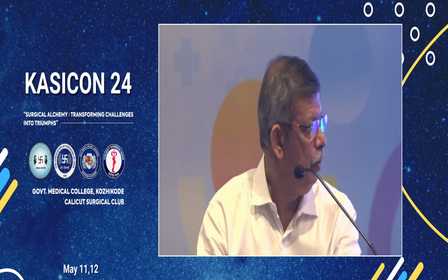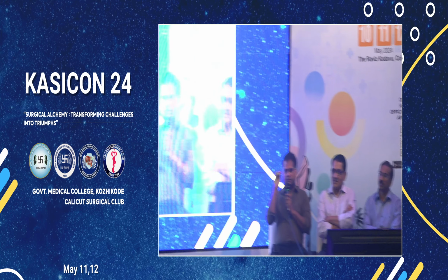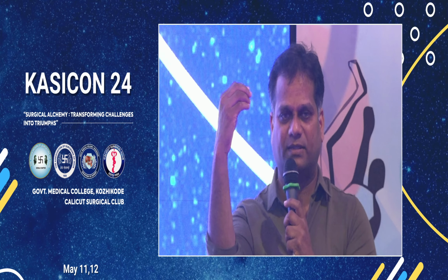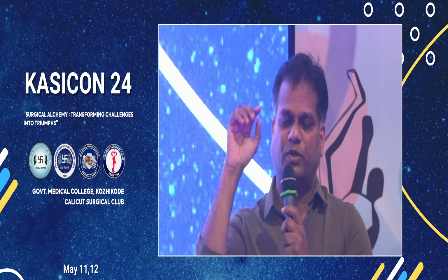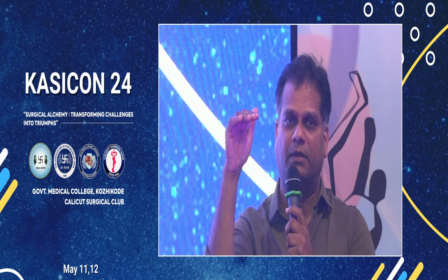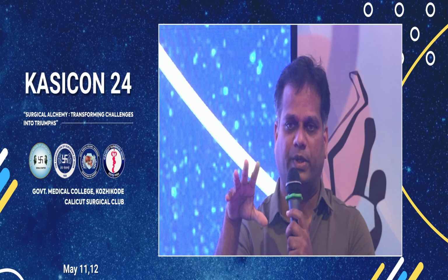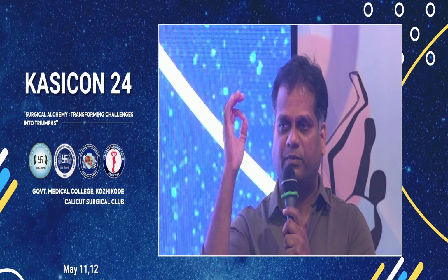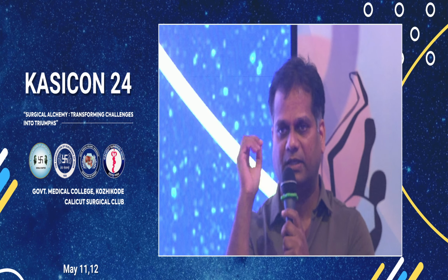Thank you, sir. A few quick points. One is for the juniors and the PGs. Make sure when you're putting in the Veress, the airflow opening is visible. Because when it goes the other way around, in spite of being in the peritoneal cavity, air won't be going, and then we are confused whether we are in the correct place. So before putting the Veress, make sure you see the outflow, the vent flow of the air, visibly, and then put it.